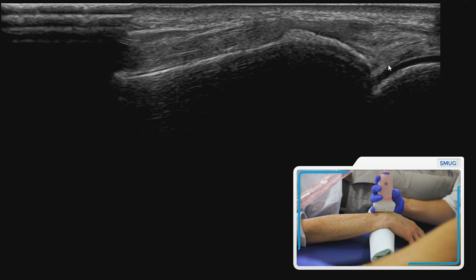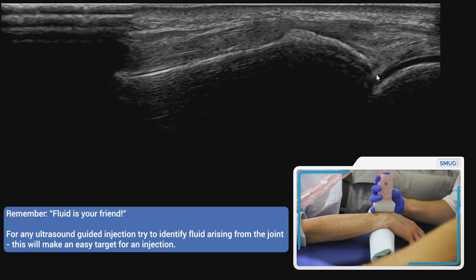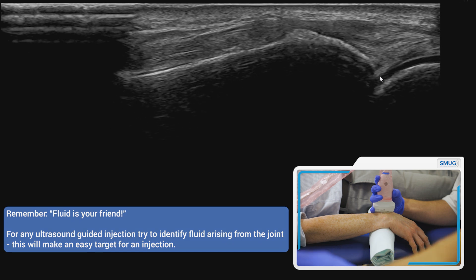This is the articular cartilage, this will be the joint recess, and the capsule over the top. If you do have a little bit of fluid in the joint — fluid is your friend — you can aim for that and it will go nicely into the target there.